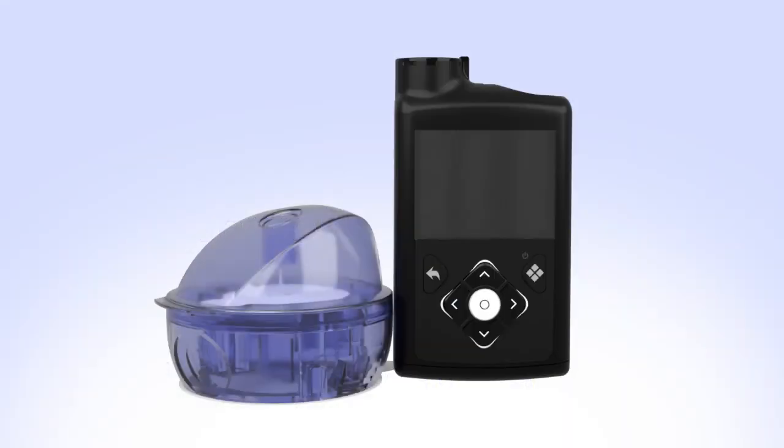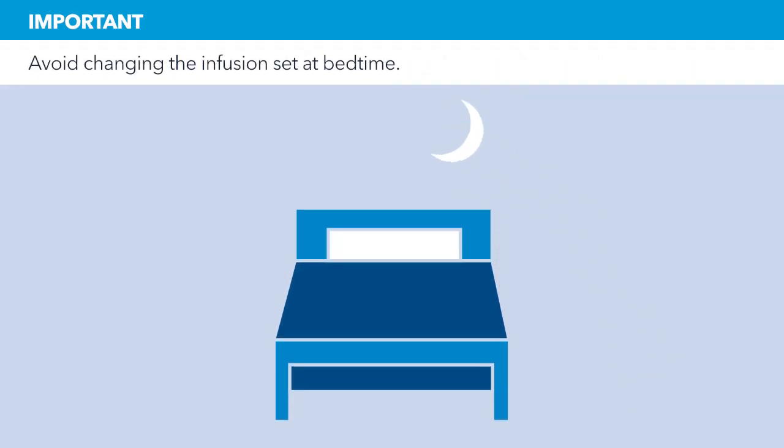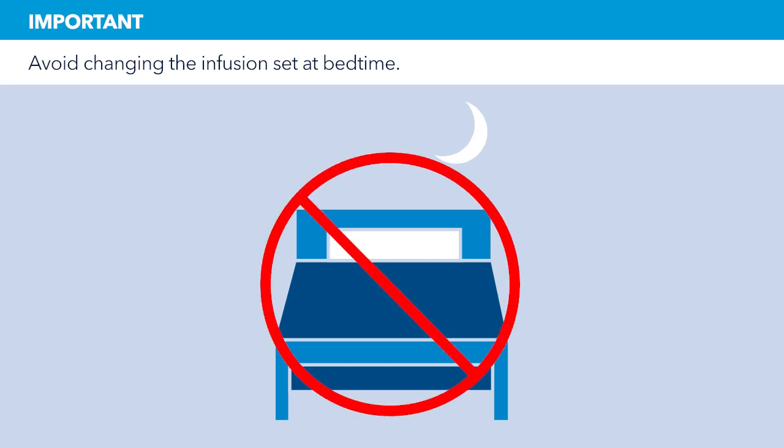This video will show you how to fill the reservoir and insert the infusion set. It is important that you follow the instructions as they are shown in this training. Try to avoid changing your infusion set before bedtime unless you're able to check your blood glucose 2-3 hours after inserting.